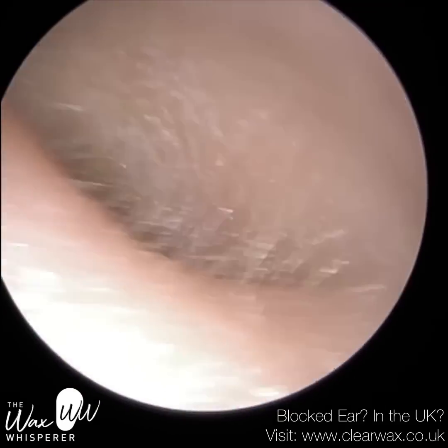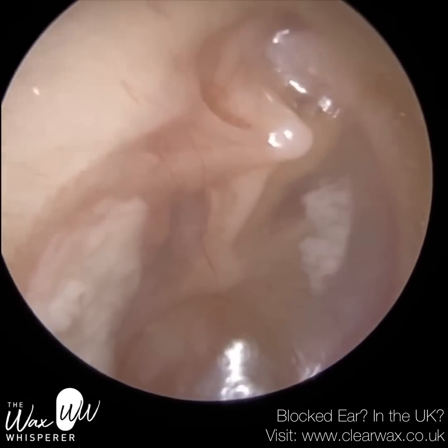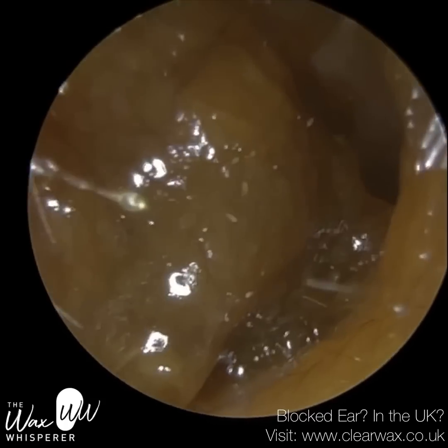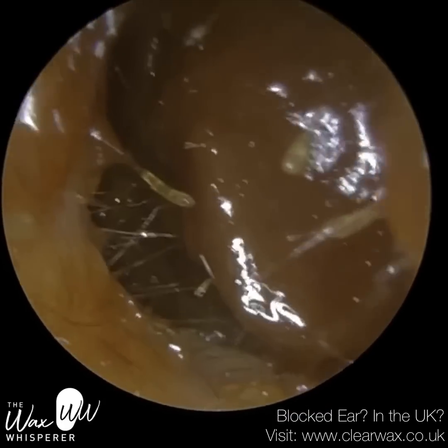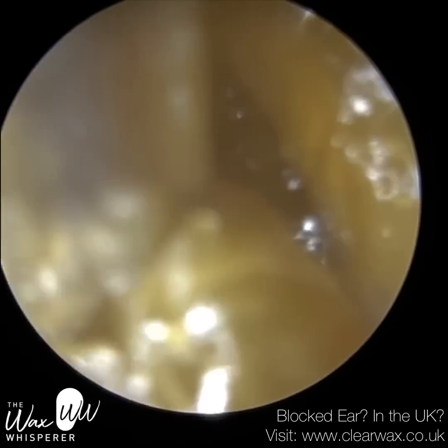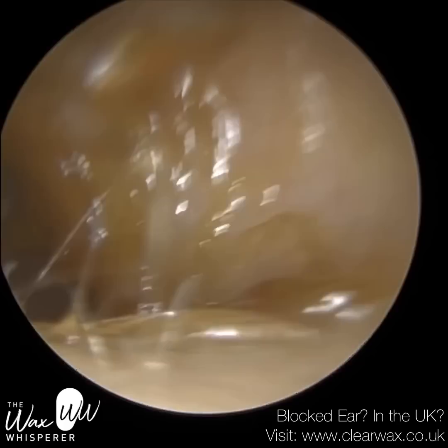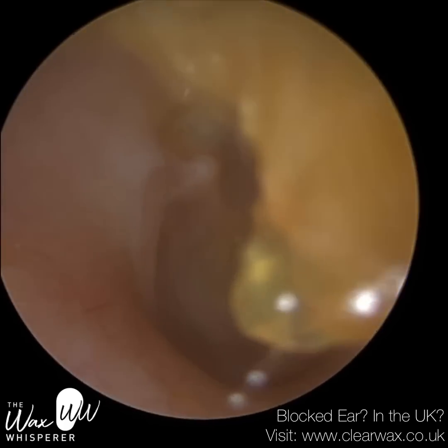Normally the neck and head of the malleus are located behind the eardrum, so they've got glue ear here. The reason why that bone has been eroded is because when the eardrum gets sucked in, it can sometimes constrict the blood vessels, which supply blood and nutrients to the bone, and that can lead to the decay and necrosis of the bone. So that ear was severely retracted. They've had a grommet in there in the past, and I suspect the 6 o'clock region where the eardrum was sucked in is where the grommet was fitted.